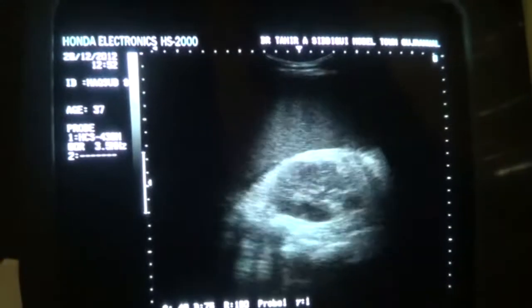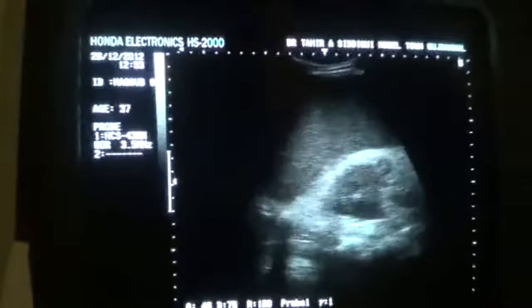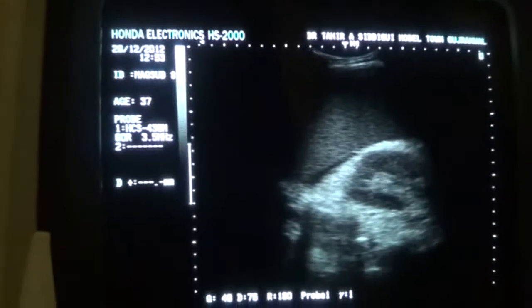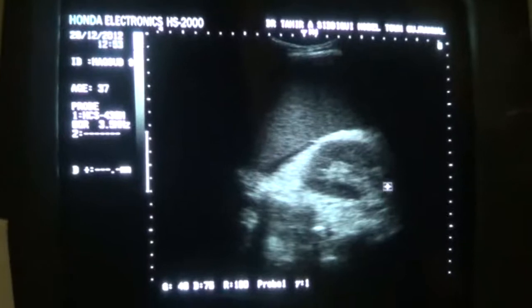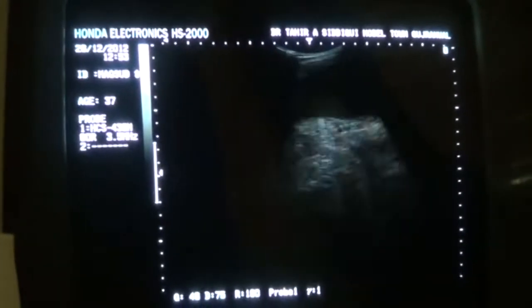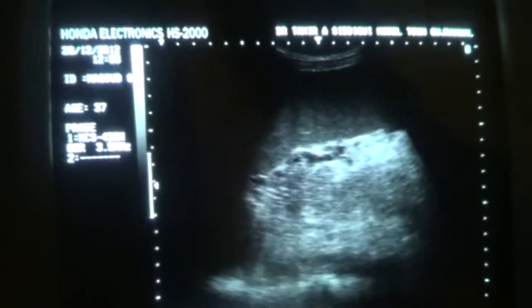Left kidney. Now this fluid is between the spleen and the left kidney. So in the spleno-renal angle, we can see fluid between the spleen and left kidney. These are varices, hilar region varices.